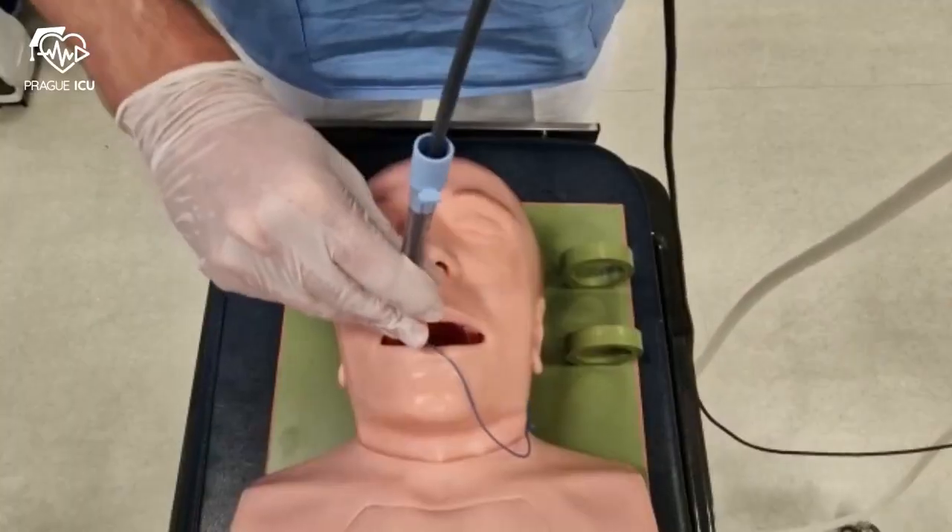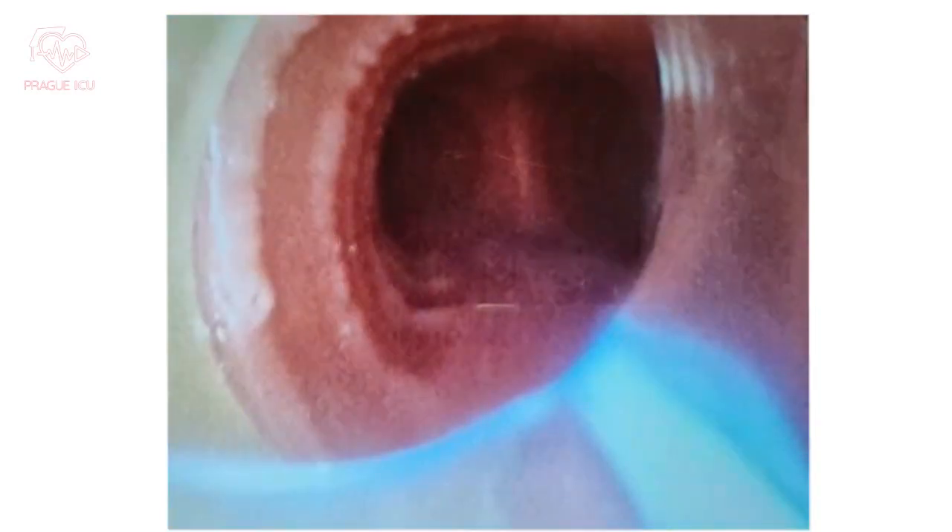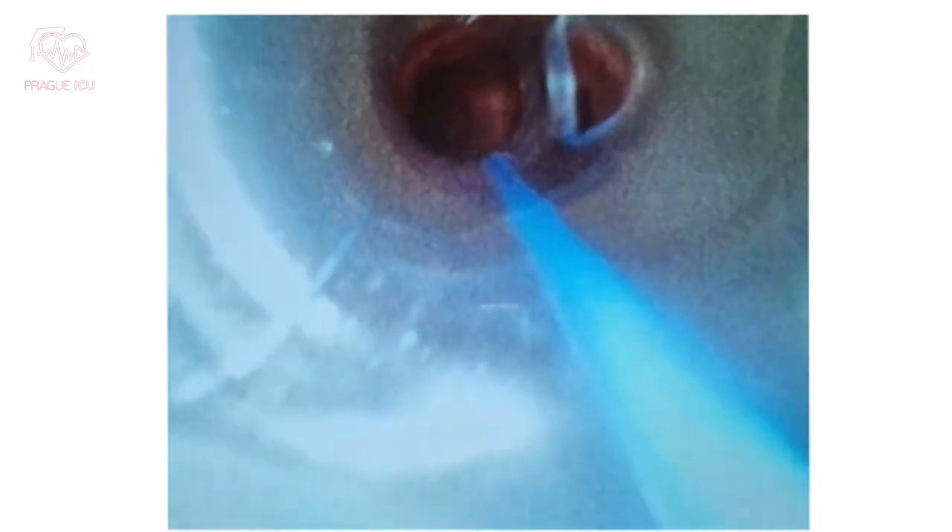Then start inserting the ET tube through the cords. When you are happy with the depth of the insertion, carefully withdraw the scope.